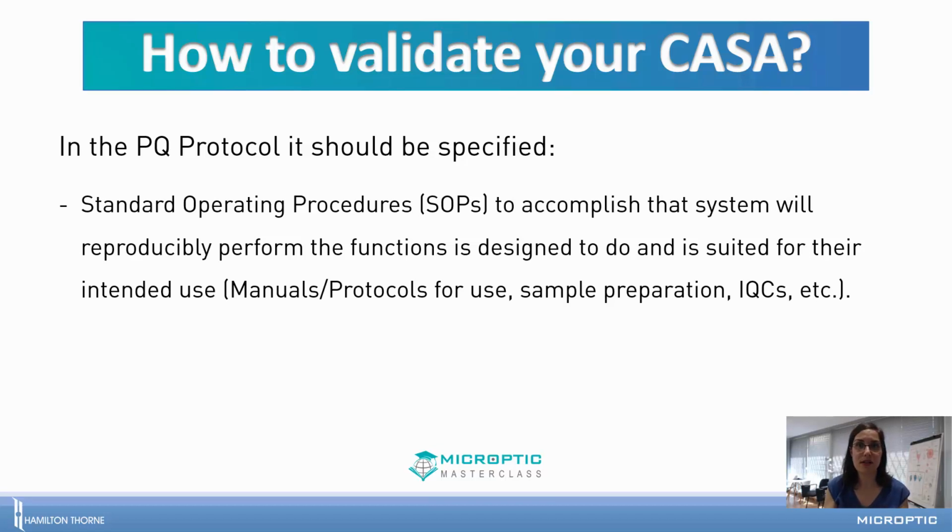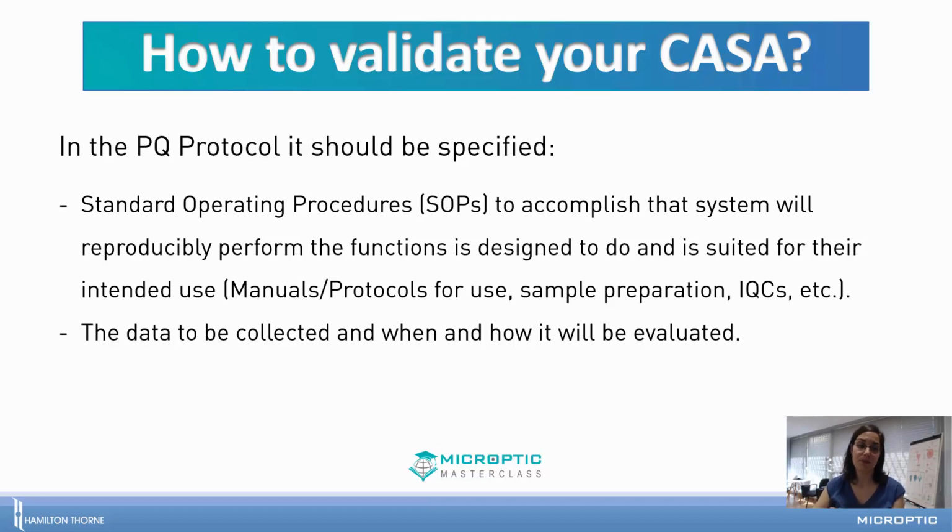The flow charts included in the user manuals could be useful to get an overview of the steps and how to run each test, to decide if you want to add manual corrections or if it's not required, and all the things you consider important for running all the tests in the same way during this validation and obviously during your routine.